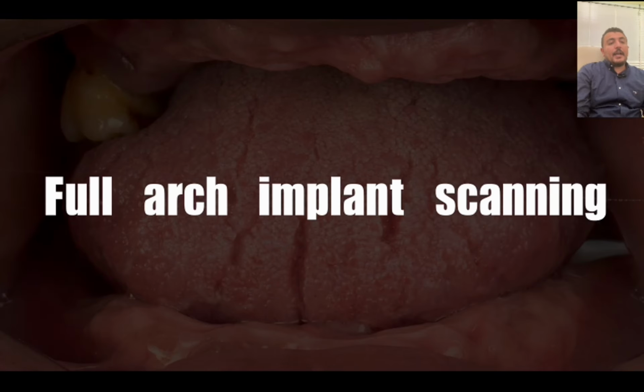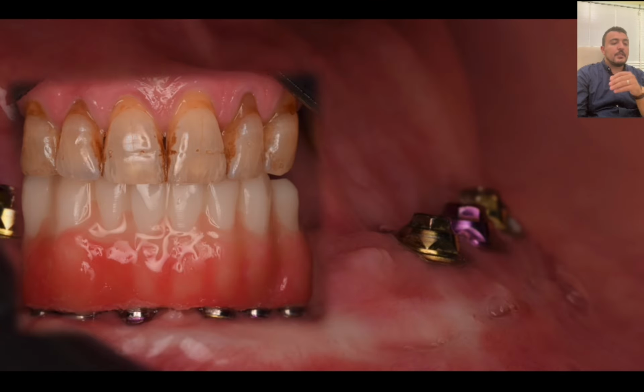Sometimes we have another technique that is much easier when we have ideal vertical dimension and good centric relation, like with a temporary restoration done during the guided surgery with a stackable guide. So we have a very nice temporary restoration with very nice vertical and centric relationship. So we can do what we call reverse scan body.